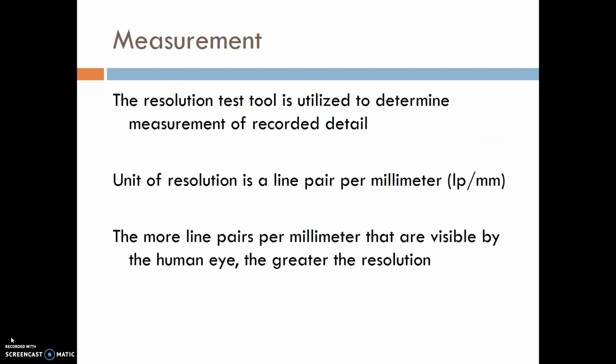The resolution test tool is utilized to determine measurement of recorded detail. The unit of resolution is a line pair per millimeter. The more line pairs per millimeter that are visible by the human eye, the greater the resolution.